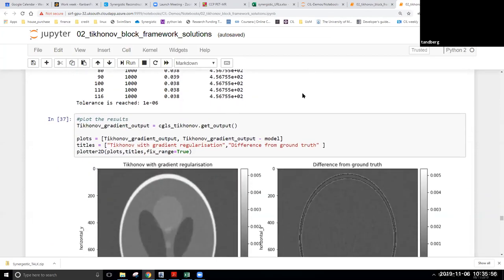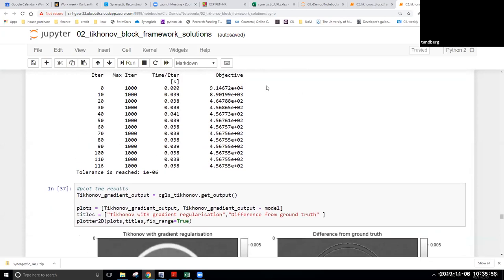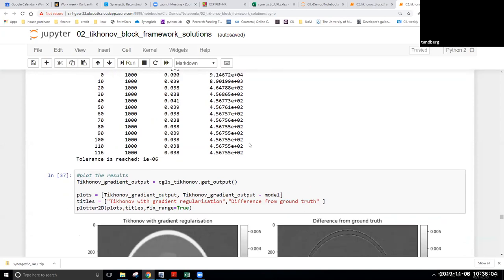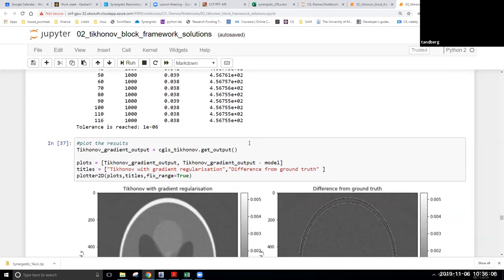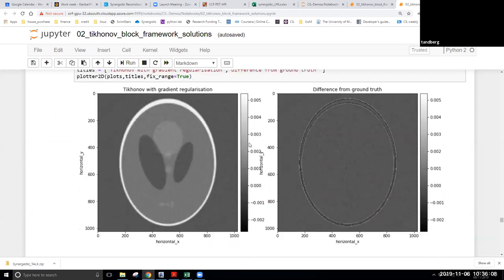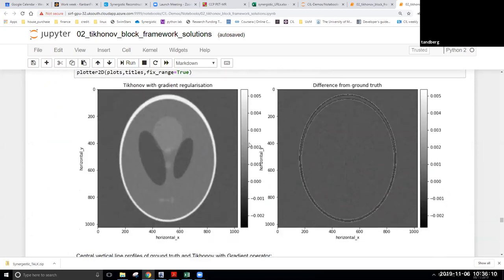And running, we see now that our objective is settling down on some value here, so hopefully that means that we have seen it converge to the solution we were after. And again, depending on the regularization parameter you've picked, you will see some trade-off between getting rid of the noise, but preserving enough details.